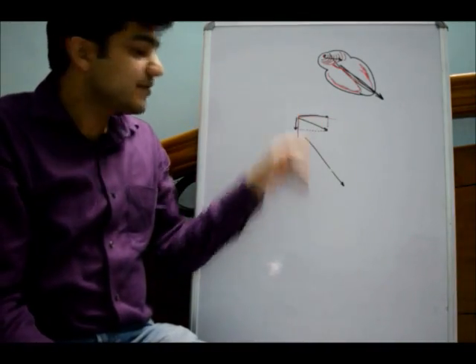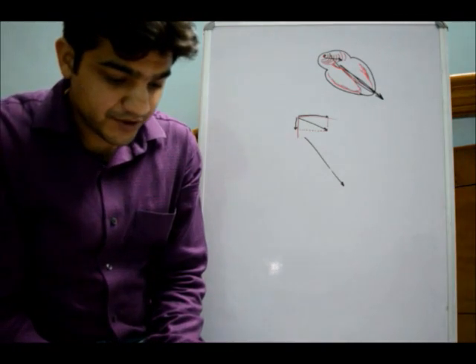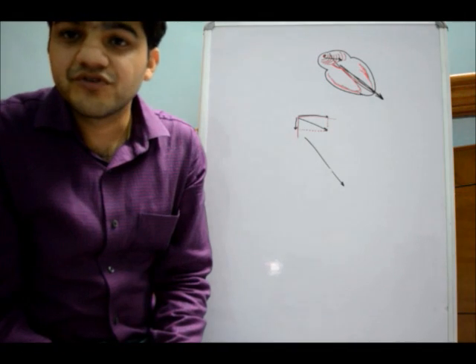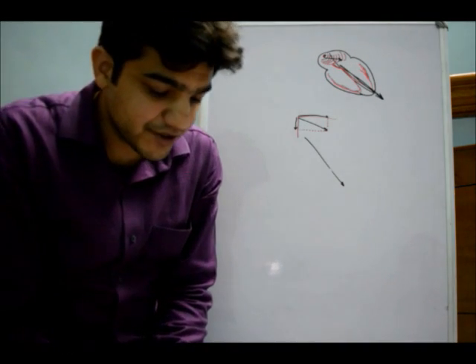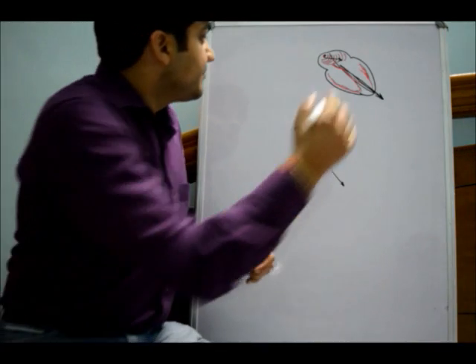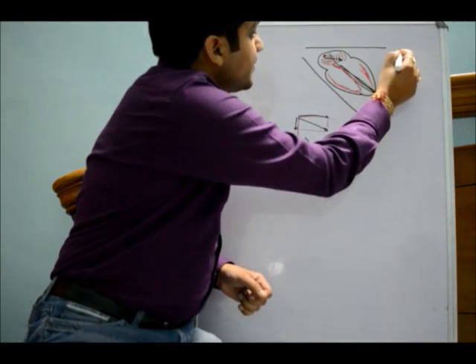Okay, but when we are using the ECG, we do not have perfect horizontal and vertical axes. We have a triaxial system of vectors. That depends upon the placement of the various electrodes on the body, and how these electrodes are placed is given by Einthoven's triangle, which is an equilateral triangle made around the heart, somewhat like this.